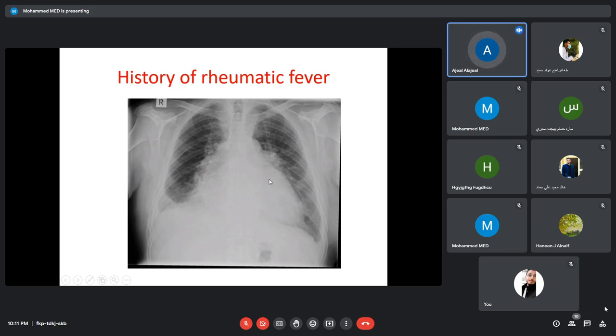You can see again the left ventricle, go up to the left. Yes, this is the appendage, a prominent left atrial appendage, and above it is the pulmonary artery. And this one is the aortic knuckle. Yes, this is the aortic knuckle.